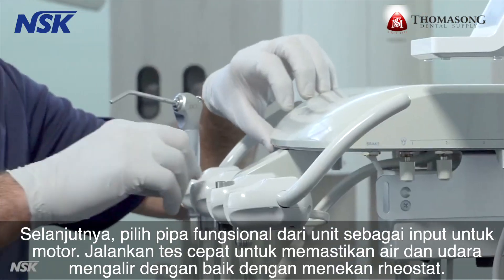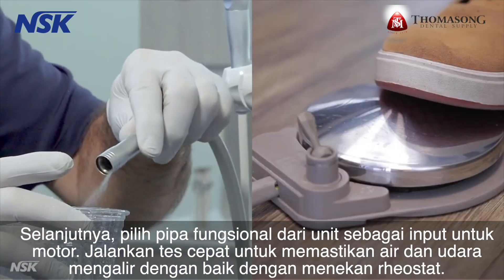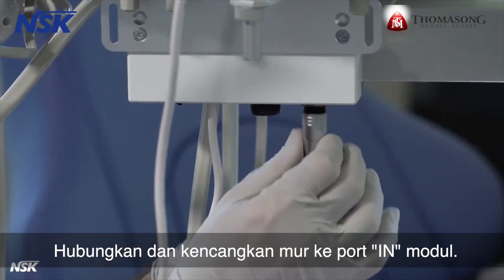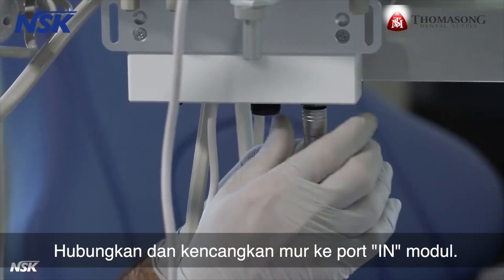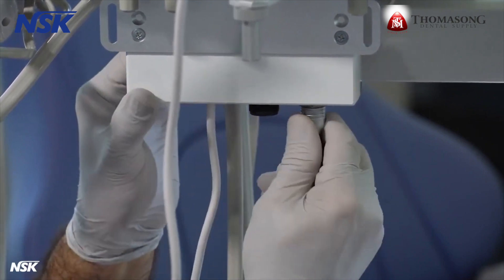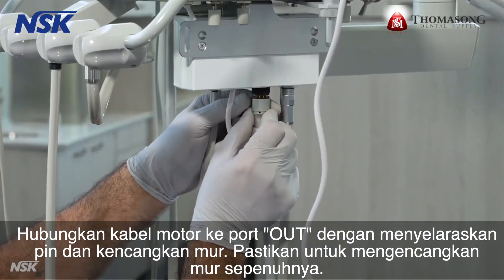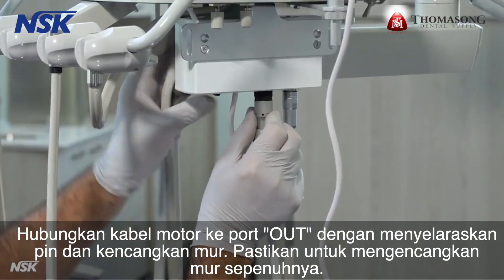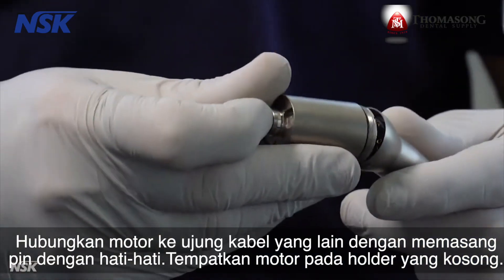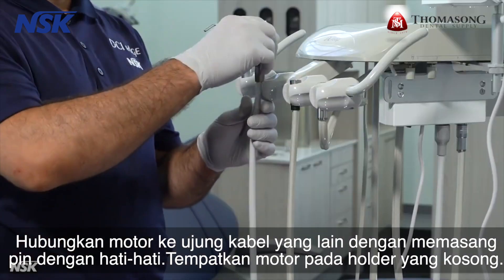Next, pick a functional tubing from the unit as the input for the motor. Run a quick test to make sure water and air are flowing properly by pressing the rheostat. Connect and secure the nut into the end port of the module. Connect the motor cord into the out port by aligning the pins and tighten the nut — be sure to tighten the nut completely. Connect the motor to the other end of the cord by carefully lining up the pins, then place the motor on the vacant hanger.